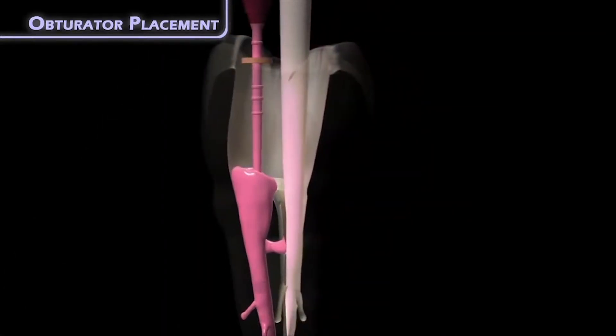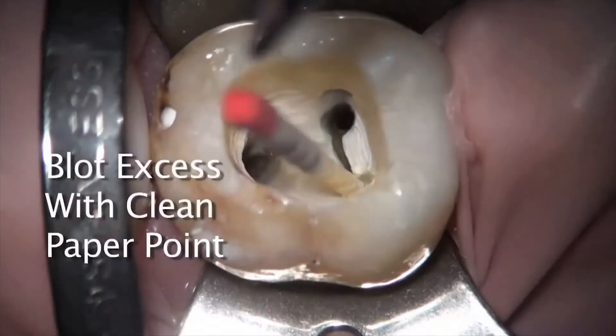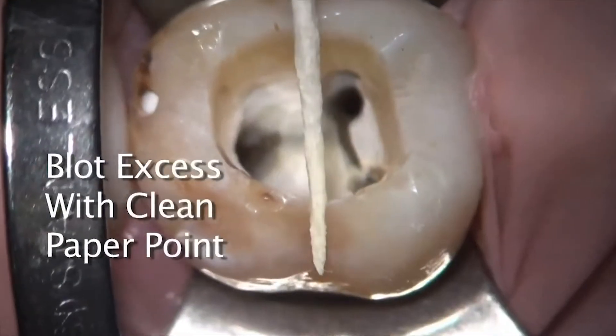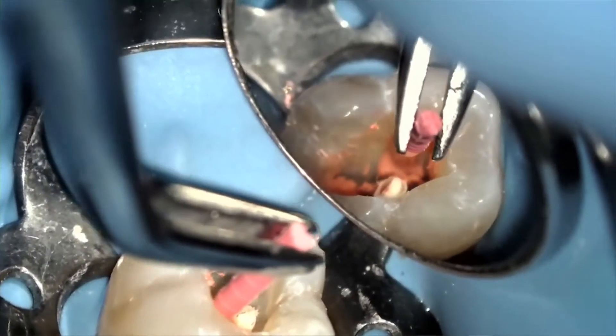In teeth with multiple canals which benefited from blocking out adjacent canals, you may at this time remove the paper point from the next canal to be obturated. And of course, prior to obturating that canal, line the canal with a bit of sealer and proceed with the gutta core obturation as I've just shown.